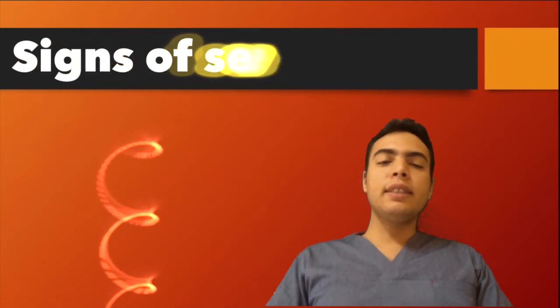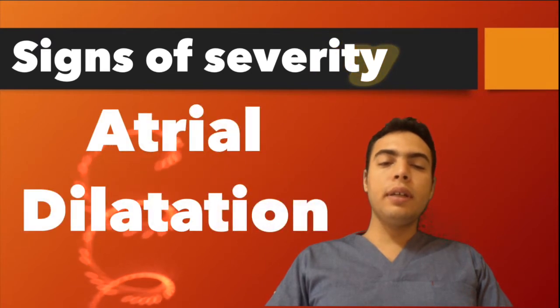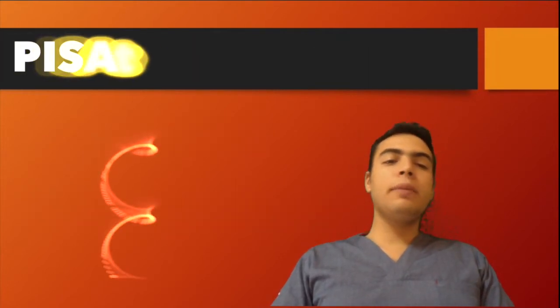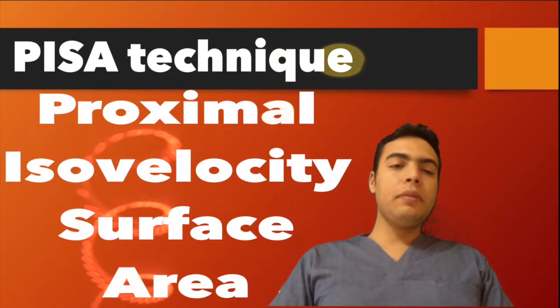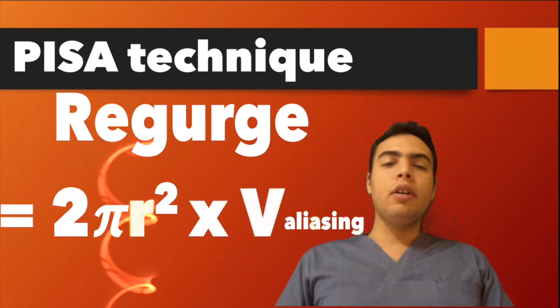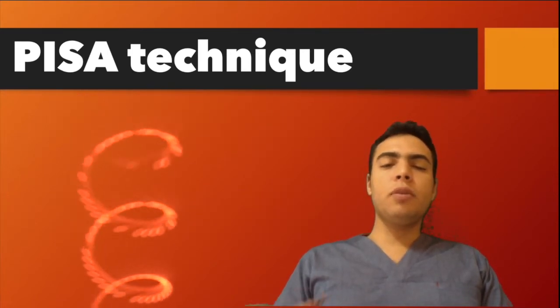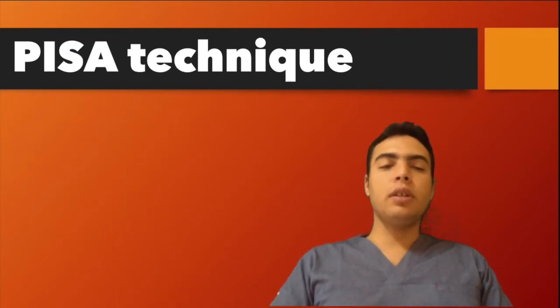Another sign suggesting severity is dilatation — dilatation of the left atrium indicates severe regurgitation. We can also use the proximal isovelocity surface area, the PISA technique, to measure regurgitant flow and assess severity. It is more difficult and requires more sophisticated devices than vena contracta measurement.